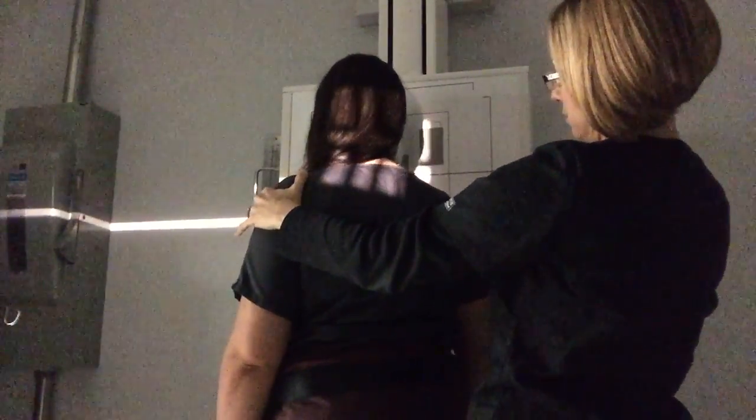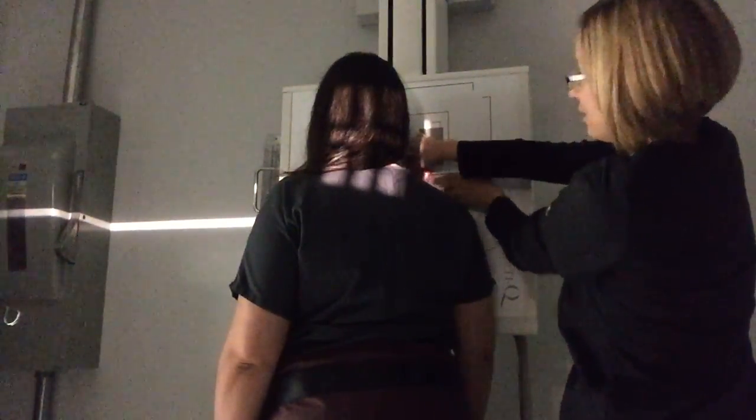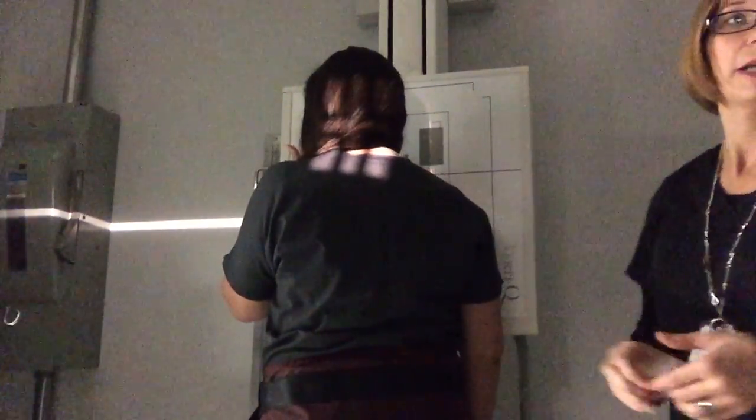Then we're going to do the same thing on the other side, rolling the patient this way. Same centering point. Put the right marker on the IR since this is her right side. Move her a little to make sure she's centered. Have her lift her chin up just a little, then expose at 85 kVp with the patient holding her breath. That is your AP and PA oblique C-spine.